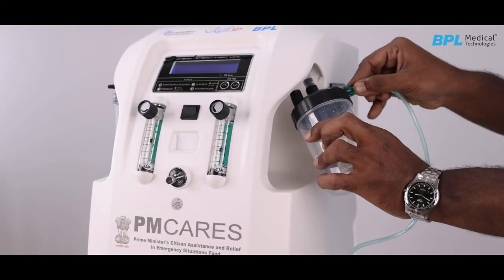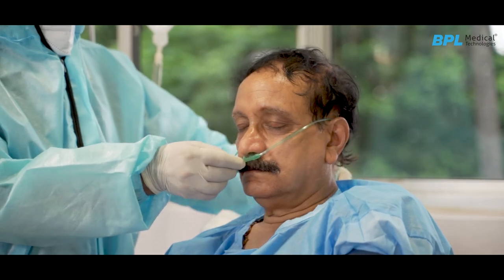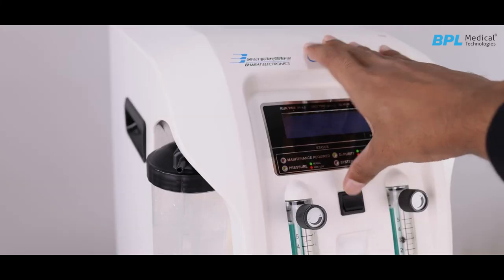Connect the nasal cannula to the oxygen outlet, and the other end to the patient. To stop oxygen therapy, take off the nasal oxygen cannula from the oxygen outlet first, then turn off the power switch and cut off the power source.